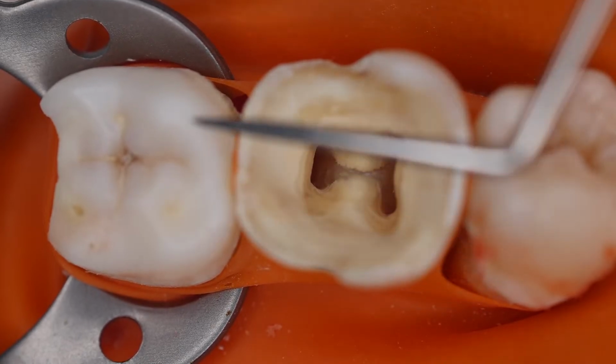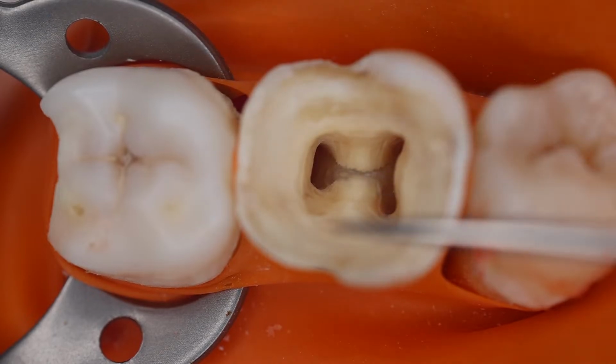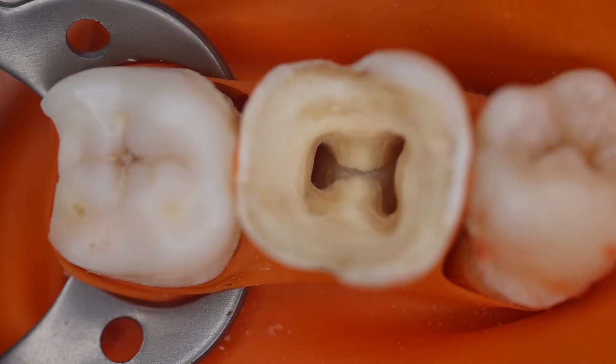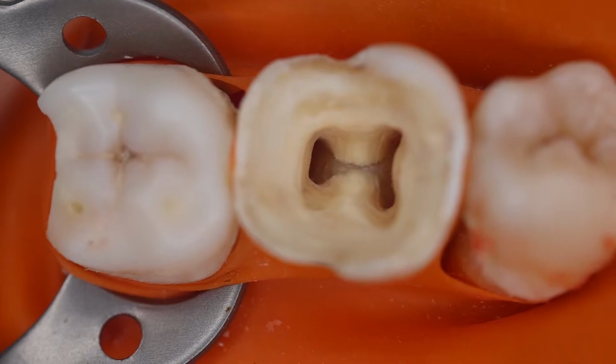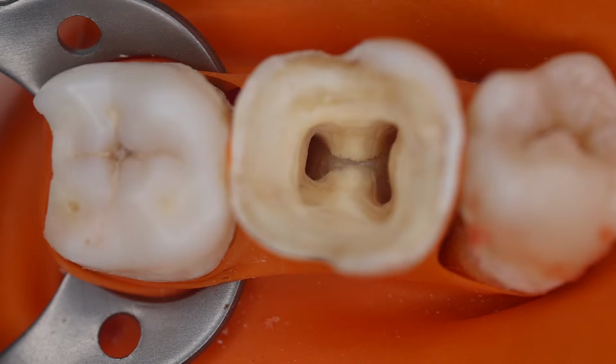We could retain the healthy tooth structure as the reference point at which we would be working when we have determined the working length. There is an ongoing poll on the best method to accurately determine the working length. So the options have been given, and you could consider them.